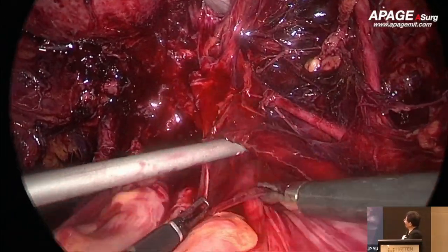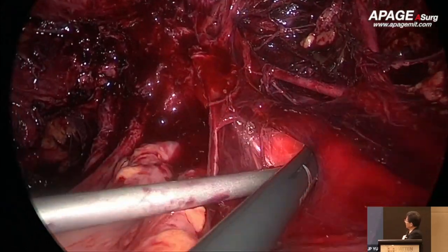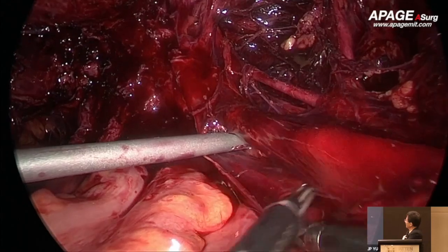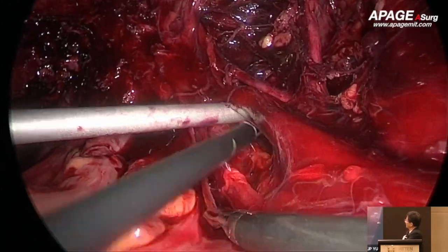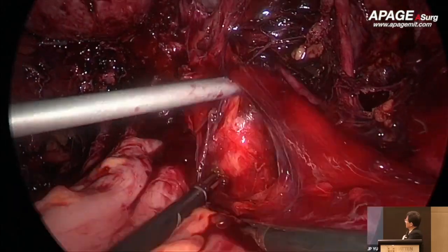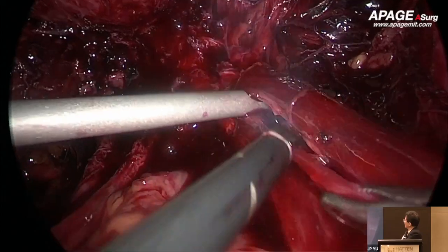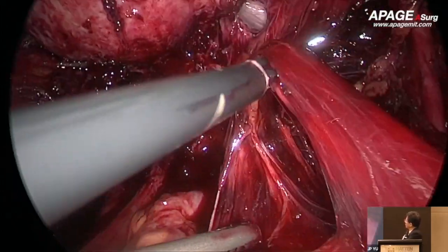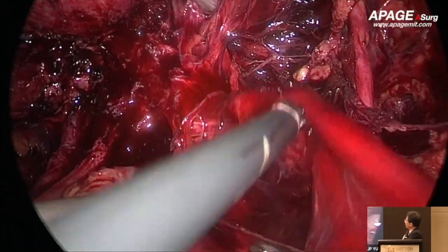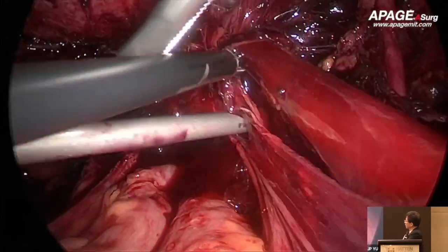In HIFU, you don't go into the pelvis, you just apply thermal energy on the lesions, and then they destroy the lesion. And there is still not any evidence for treating cervical cancer with HIFU. So we still need to do the surgery to identify the lesions and see where the pathology is.